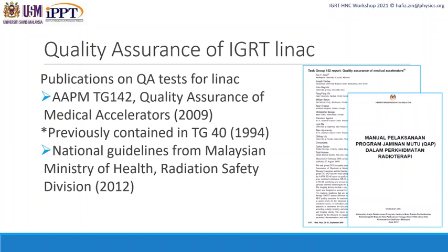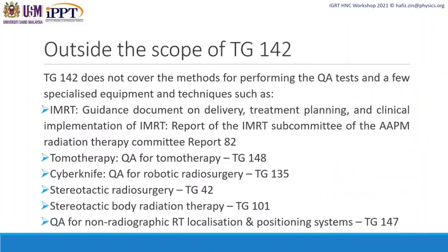For QA tests for LINAC, we have AAPM TG142 as our main reference. And also we have national guidelines from the Malaysian Ministry of Health from the Radiation Safety Division. However, TG142 does not cover the methods for performing the QA test and a few specialized equipment and techniques such as the following.